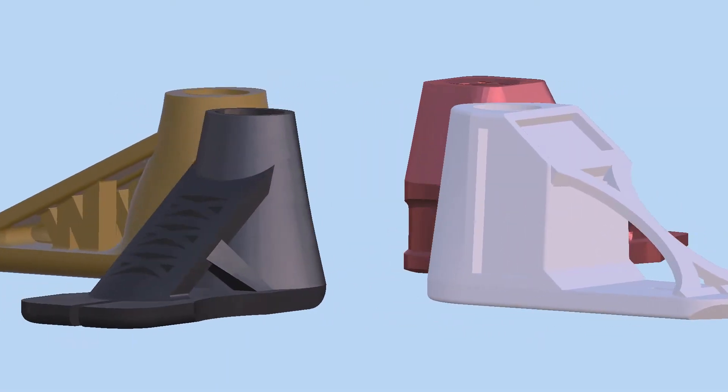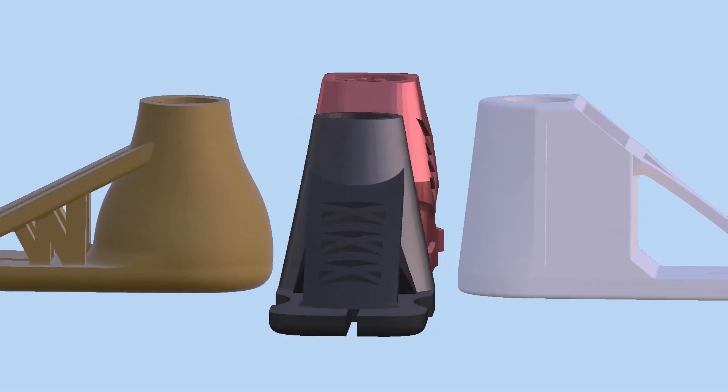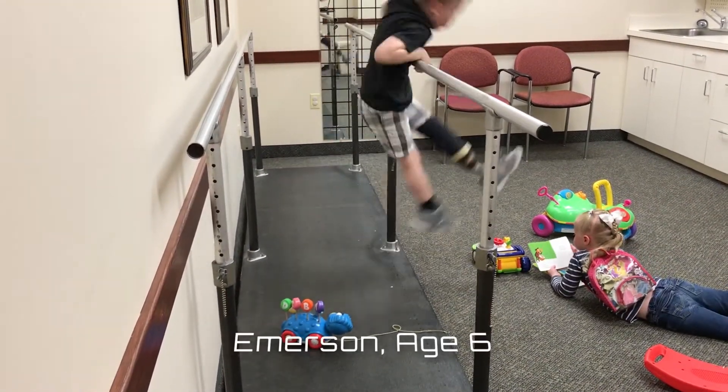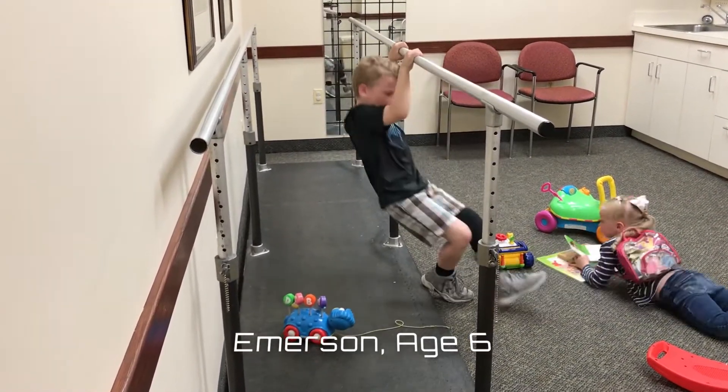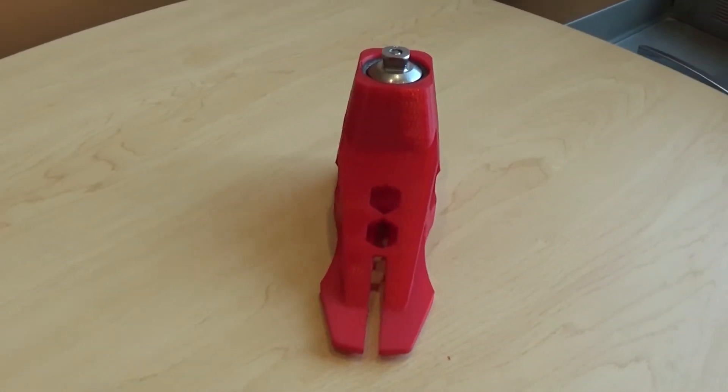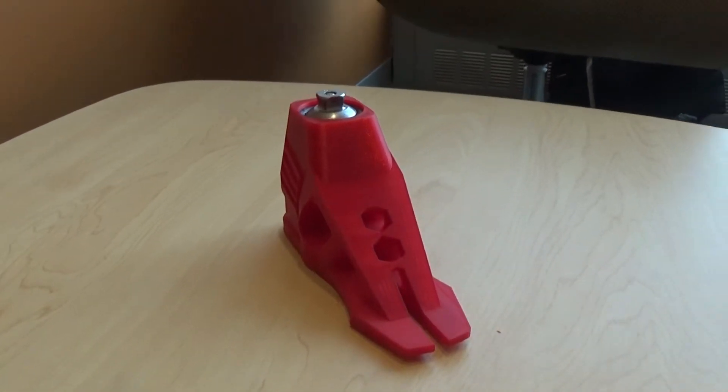Indestructibles is a 3D printed set of prosthetic feet designed to withstand the forces of active and unpredictable users, namely a rambunctious six-year-old boy named Emerson. Five key features assist motion and comfort for the child during the entire gait cycle.